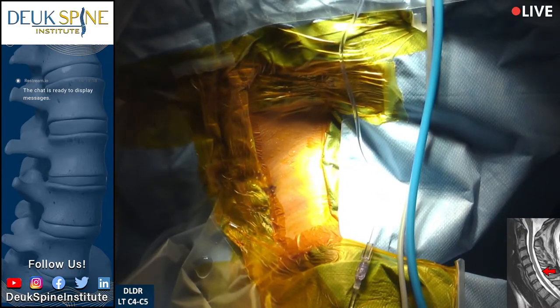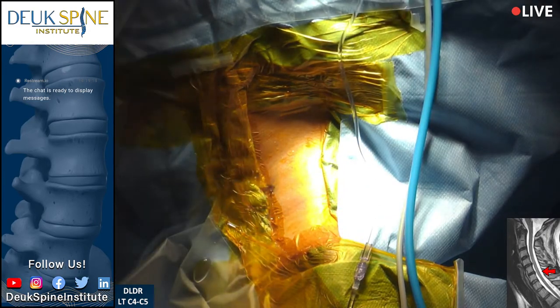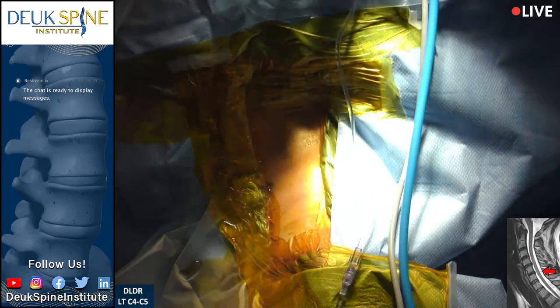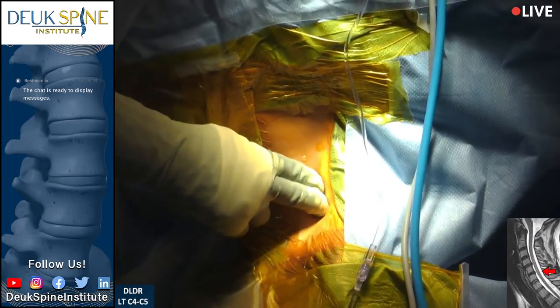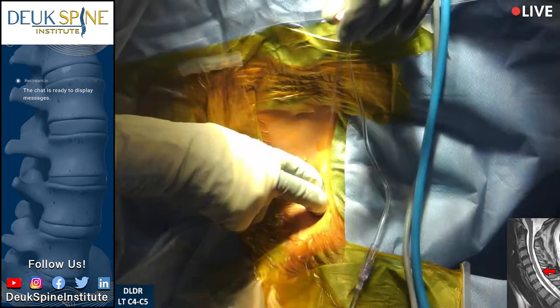What we need to do at this point — I need you to put her head in slight extension, because as I'm pushing down her spine is kinking forward and kyphosing. We've given some more muscle relaxer, and I can feel the spine.